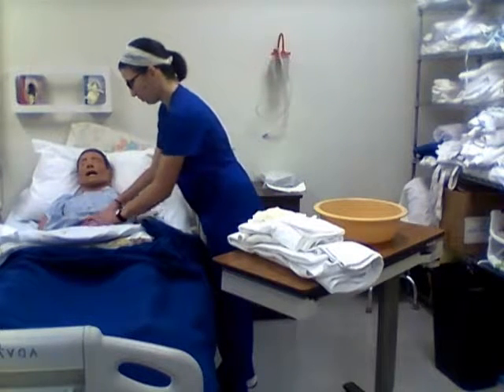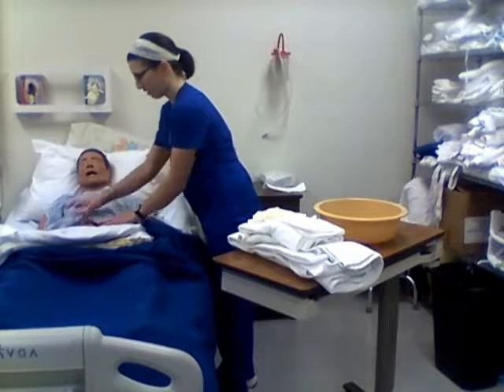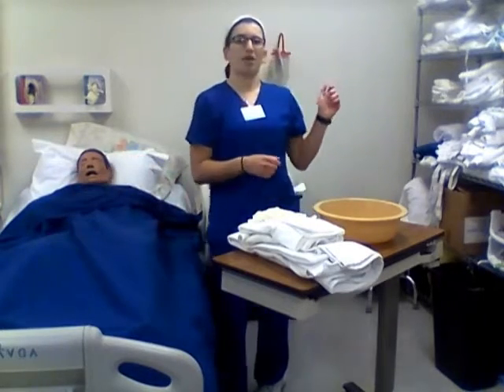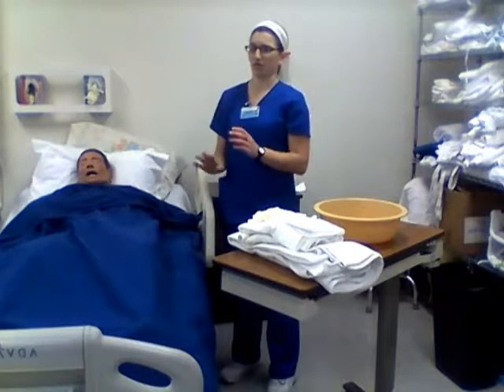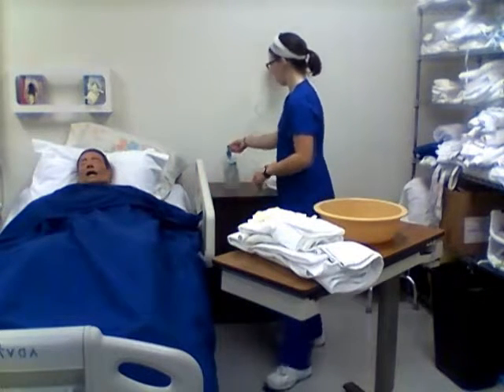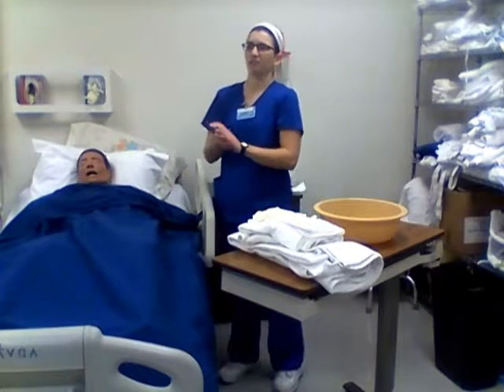So I'm going to go ahead. Everything looks fine. There's a little bit of a bump, but that's going to be normal because she's having some urinary retention. So I can cover her back up, and before we actually start, I'm going to provide privacy because we want her to be in a nice environment. That way she's not uncomfortable or feels awkward. All right, so now I can go ahead. I'm going to perform hand hygiene again for 15 seconds.